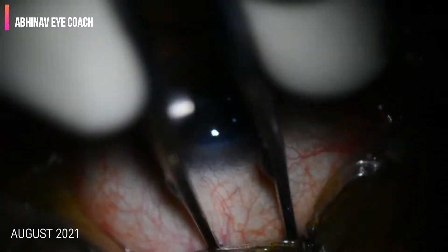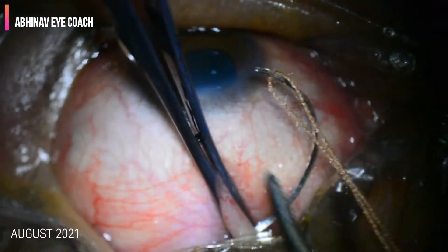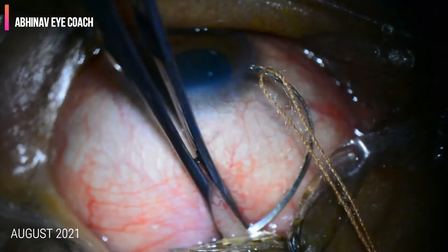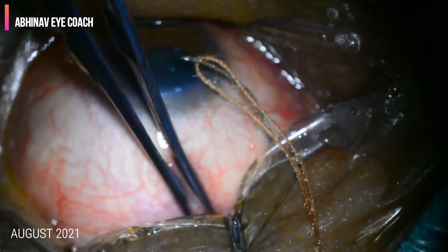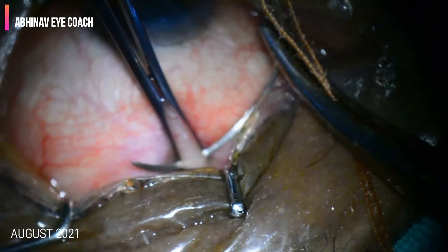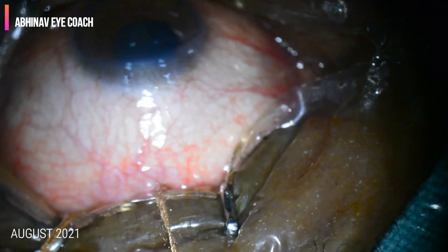To start with, we will place a traction suture — a superior rectus or bridal suture — to depress the globe downwards when we will be making the scleral flap.